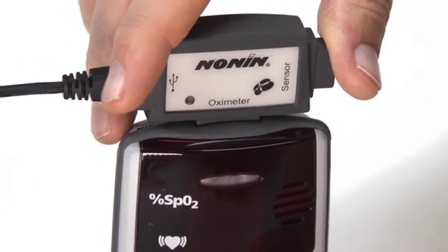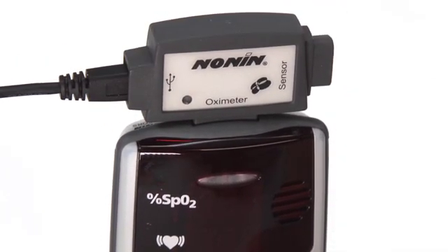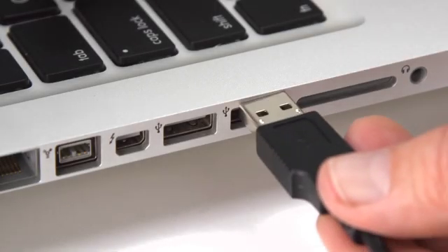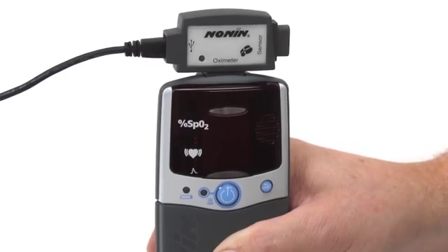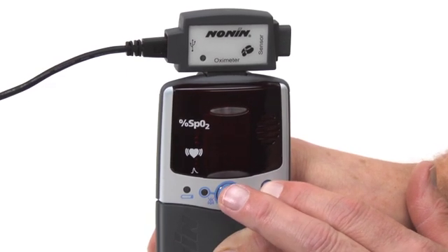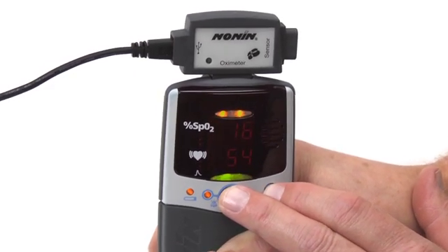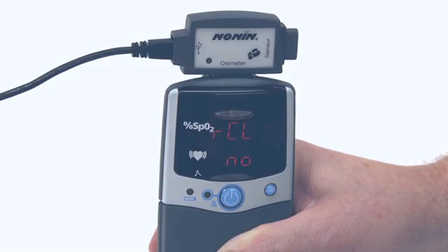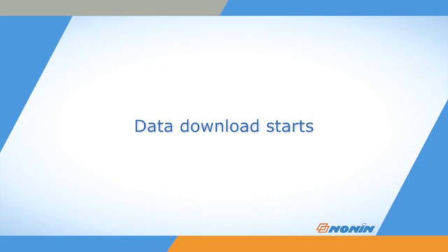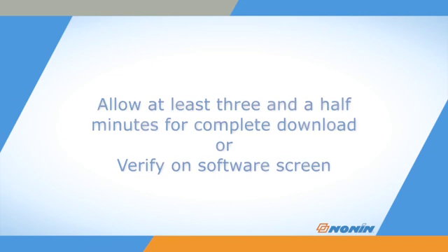To download the 72-hour memory from the oximeter, attach the appropriate cable or data collection drive with the 2500 model turned off. Press the Advance and On-Off buttons and release only the On-Off button, just like entering setup mode. When the Clear No icon appears on the 2500 model, or the Recall Alarm Setting No appears on the 2500A model, the oximeter memory will begin download. Wait for at least 3.5 minutes for the data to transfer to the computer or data storage drive.